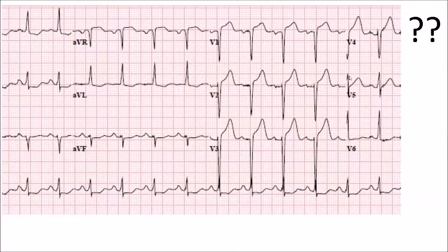And if you look at V5 and V6, you see the R wave is taller, and the S wave is not much visible. And in V1, sorry, not the left, I need to correct it. V1 is the right oriented lead. Sorry, I correct my previous word. V1 is the right oriented lead, V5 and V6 are the left oriented leads. So is the positivity more in favor of V5, V6 or V1? This is one question. Again, the limb leads are left oriented leads, so R is up.